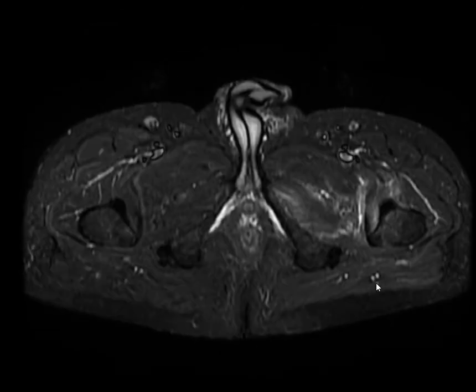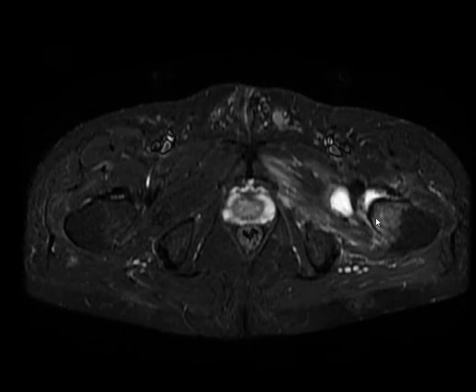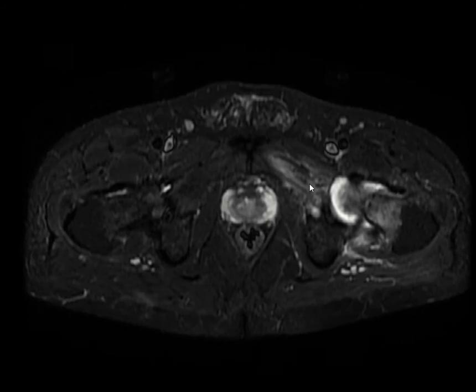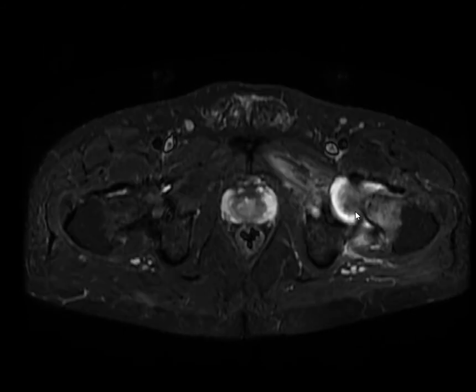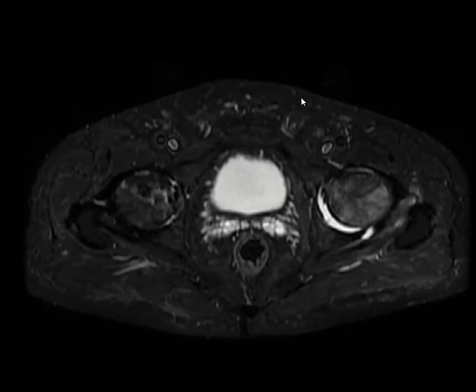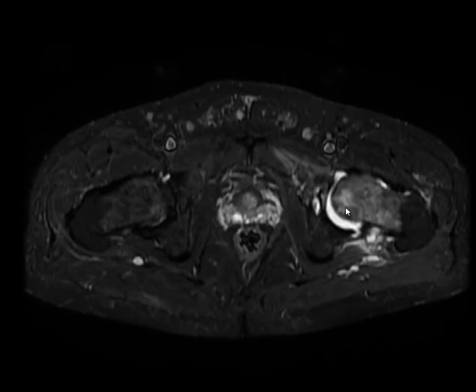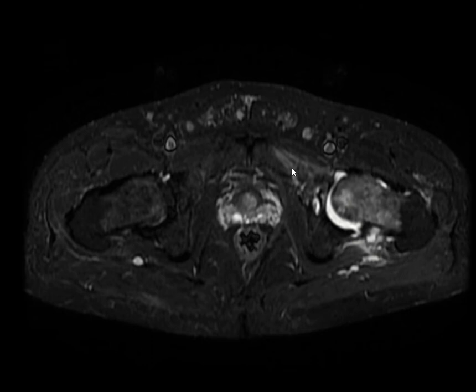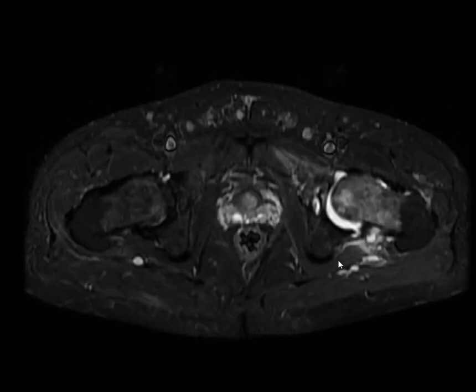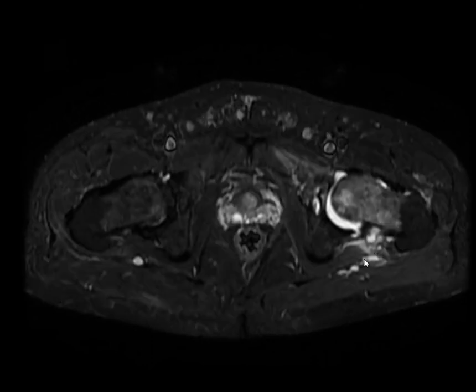But what actually stumped me is this: why are the adductor muscles showing increased intensity? I'm wondering whether this is AVN or not — does AVN lead to signal change? Why is there a signal change in this muscle? It's likely the obturator externus.